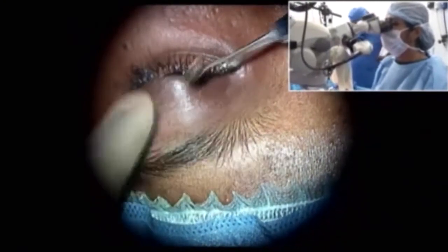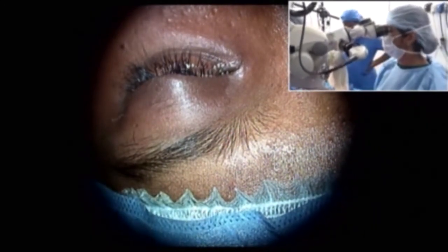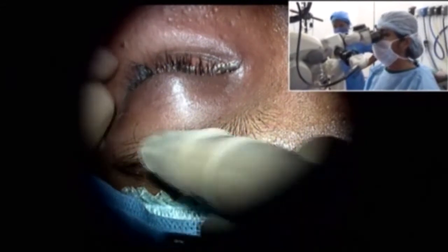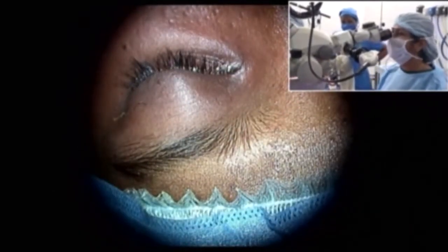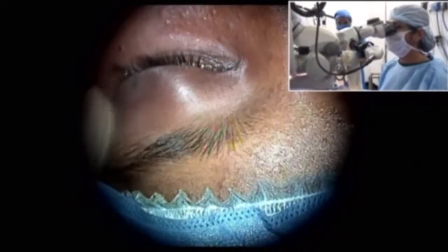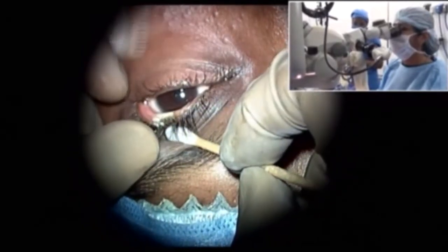The lesion is out, the margins are good, lashes are intact, so this is all we need to do. I'll show you the averted. In that half minute you have completed the surgery — so it's all done.